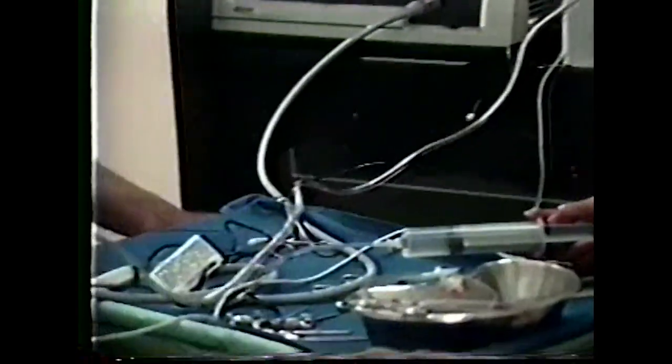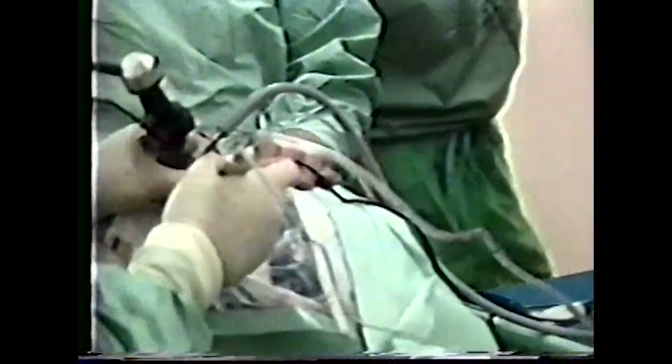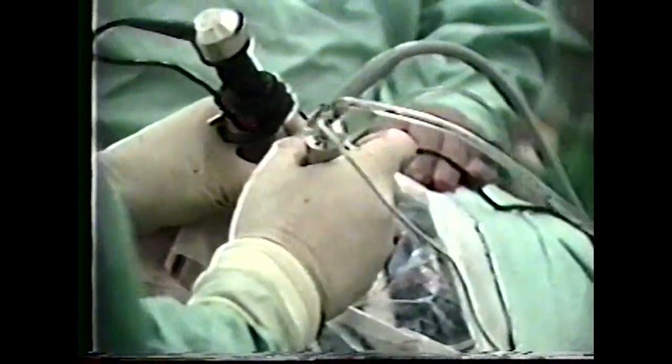To help control the suction power of the debrider, a small, self-contained suction unit is utilized. This prevents the excessive wall suction from evacuating the TM joint during the debridement process.